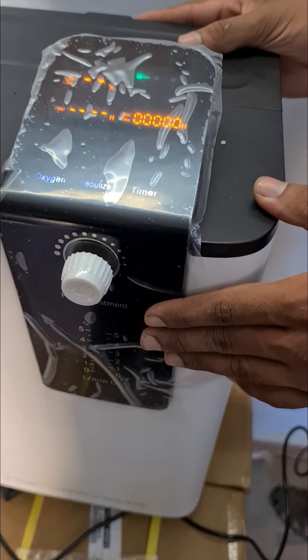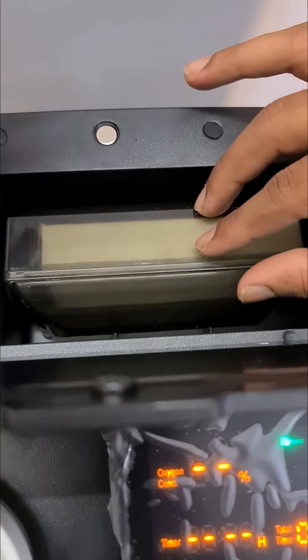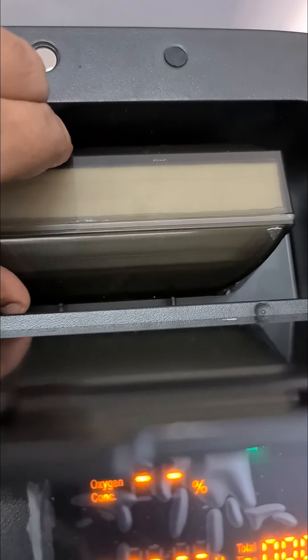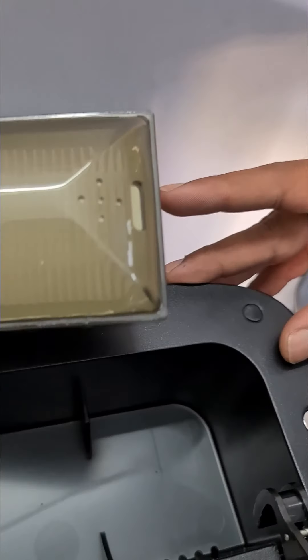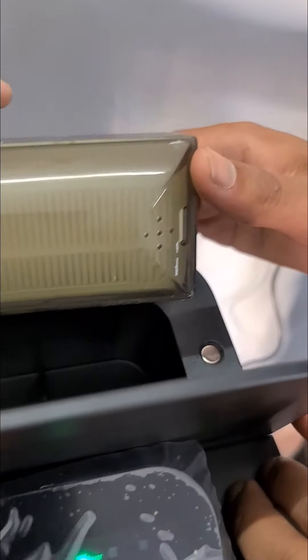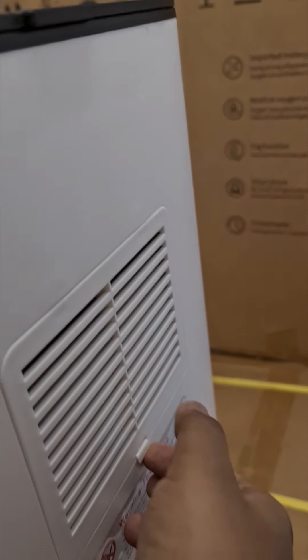Now check this compartment — here you can see there is a HEPA filter. Our team has already placed the HEPA filter in the correct position while dispatching. In case it has come out during transit, we will teach you how to reinsert it. You can see the holes — it has to always be lined to this position. There are grooves at the bottom, so the HEPA filter should always be in this position and attached properly. There is also one more filter at the back of the device — you can remove it once a week, clean and dust it, and put it back inside.